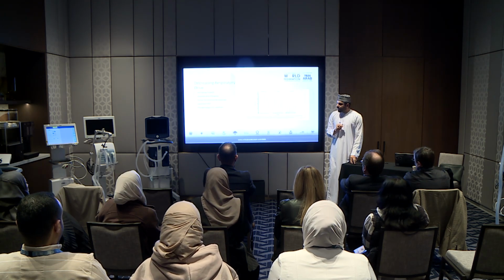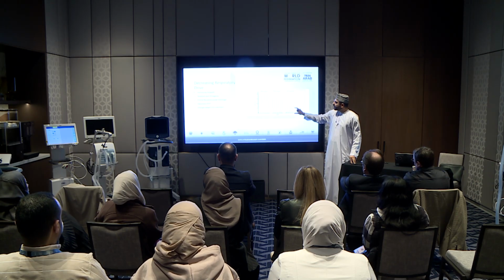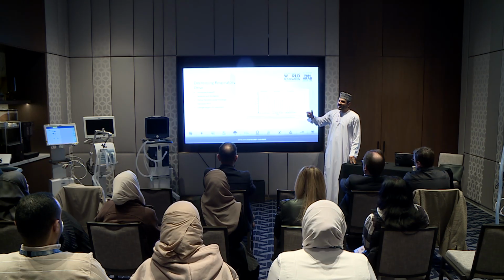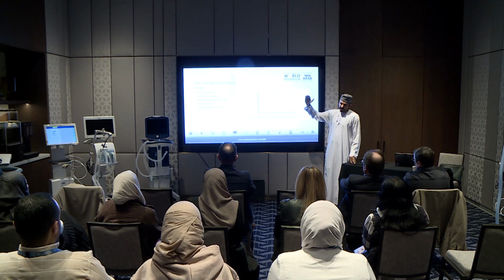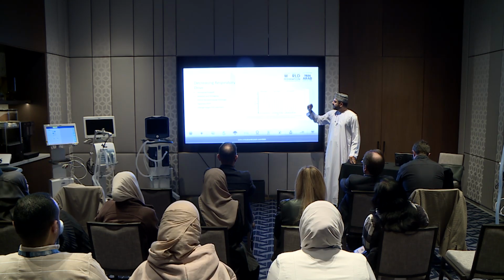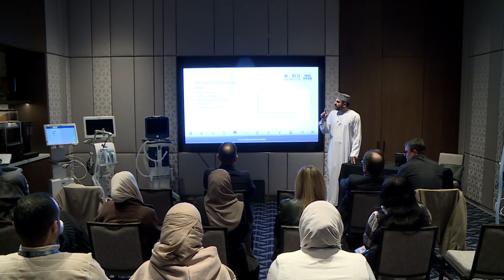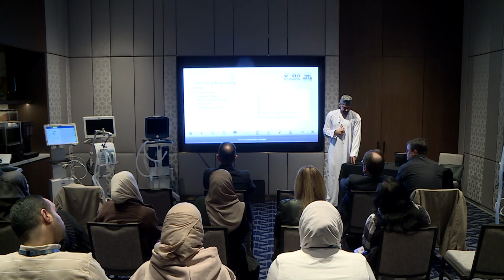One strategy you can use is increasing the support. This study showed that when you increase the patient support or pressure support, it makes sense, yeah? If you increase the patient support, you will see the occlusion pressure at 100 milliseconds, or the respiratory drive, decreases because of the recruitability of the lung, more support, etc. But there are other factors that will help you to reduce the respiratory drive and the respiratory effort.